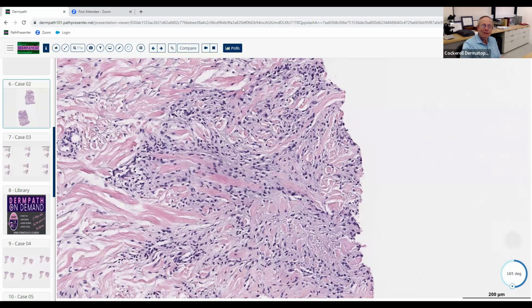If you go back and watch some of the old Western movies from years ago, or Last of the Mohicans, they have those forts with logs that they make into sharp points and stick around, and the people sit inside the fort and are protected from the enemies on the outside. That's a palisade. It refers to those sticks put into the ground to make a fort, something that protects you, if you will. So the histiocytes are like the little poles, and the people are like the material sitting inside the fort. So they're protected, if you will. That's a way to think about it.